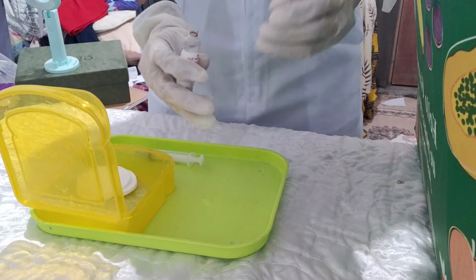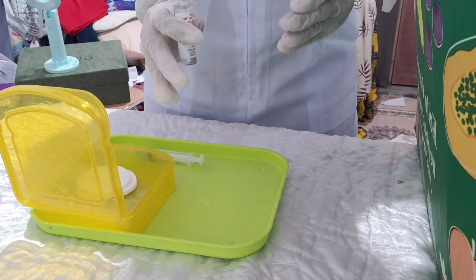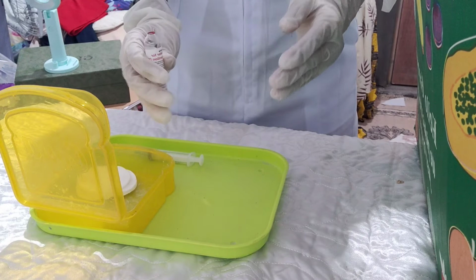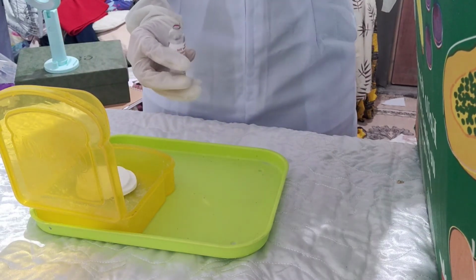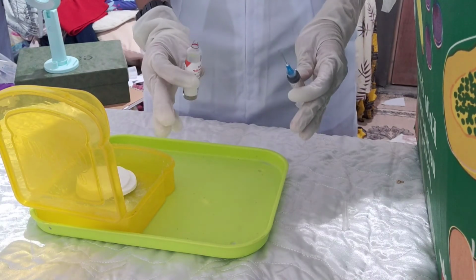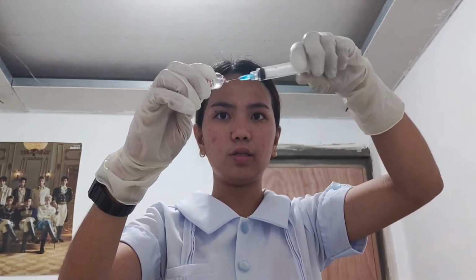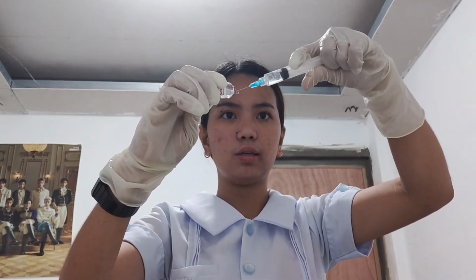Now we will insert the needle into the ampule, bevel up. We will bring the ampule and the needle to eye level. So we lift our ampule and the syringe to eye level. And now we will aspirate the calculated dosage of the medication. We will hold it like this, and then hold the syringe. Aspirate the calculated dosage.